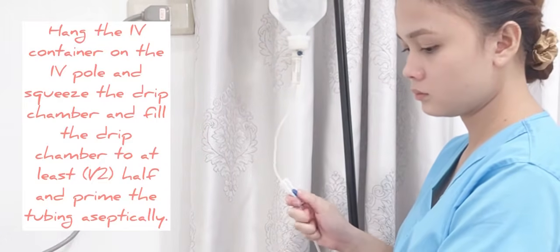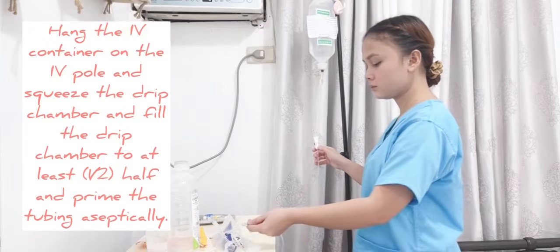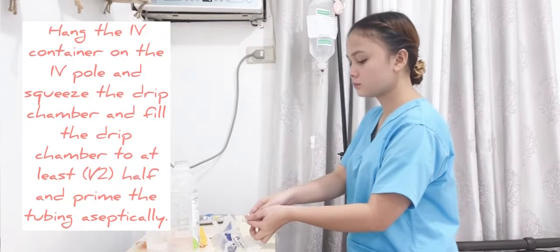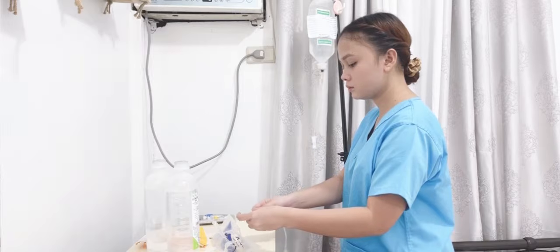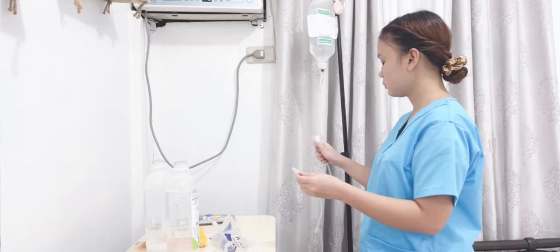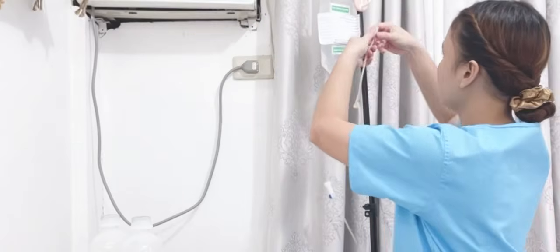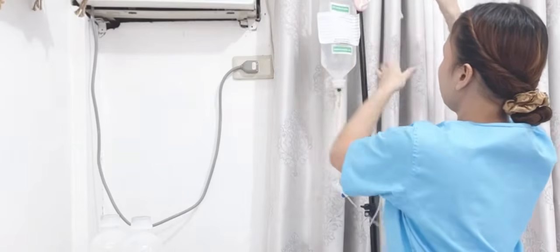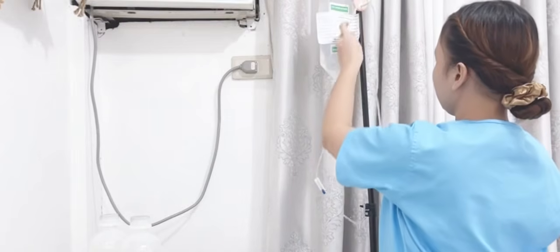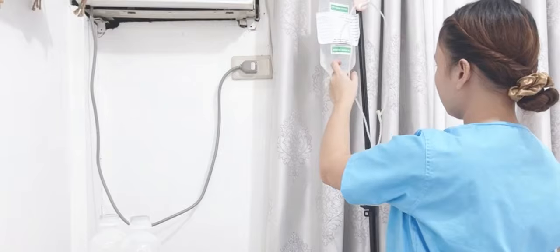Allow fluid to flow until all air bubbles have disappeared and the entire length of the tubing is primed or filled with IV solution. Then put back the cover of the distal end of the tubing. Then close the clamp. It ensures tubing is cleared of air prior to connection with IV site. Compressing creates suction effect. Fluid enters drip chamber to prevent air from entering tubing.